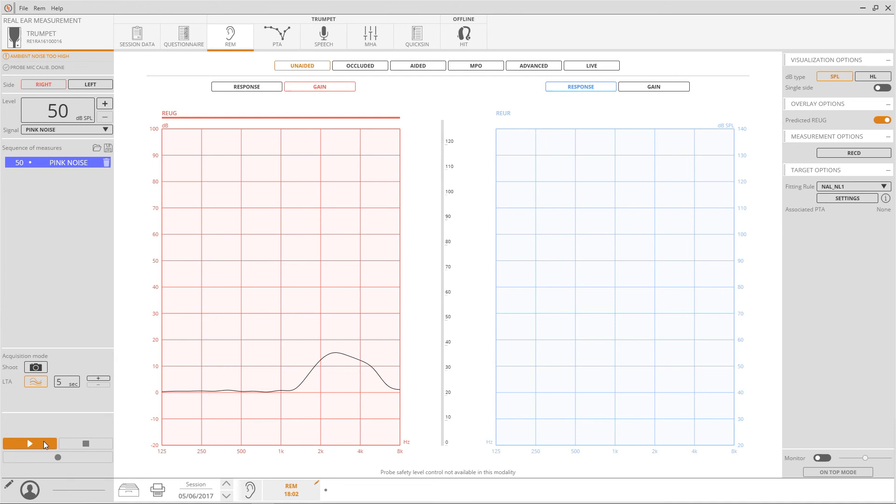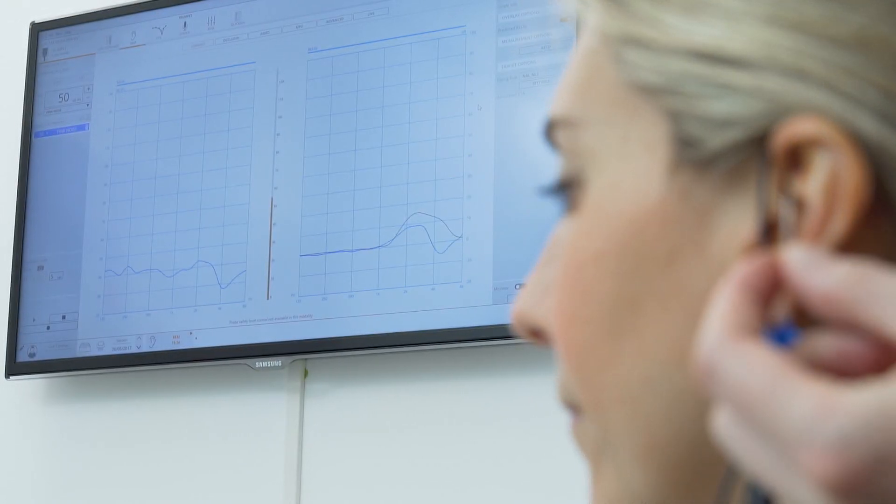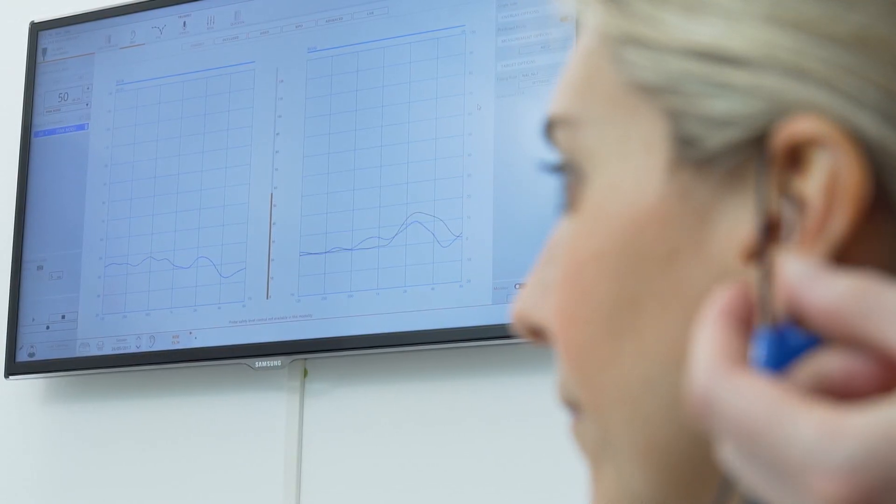By pressing the play button, the acquired curve will be displayed on the graph but not recorded, so that the probe can be adjusted until the positioning achieved is correct. When you trust that the acquired curve is okay, it can be easily recorded. The values will be kept in the software and displayed on the graph.